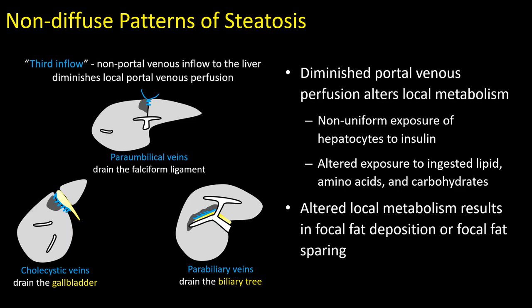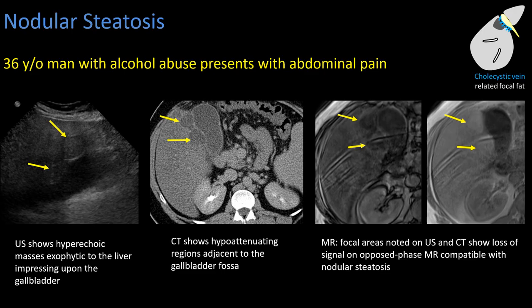Here we have a 36-year-old man with alcohol abuse and abdominal pain presenting on ultrasound with two heterogeneous, well-defined masses along the gallbladder fossa — very worrisome for neoplasm. The patient underwent CT and we see two well-defined masses with some local mass effect on the gallbladder that are low in attenuation.